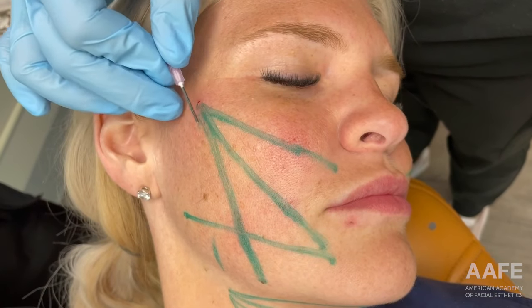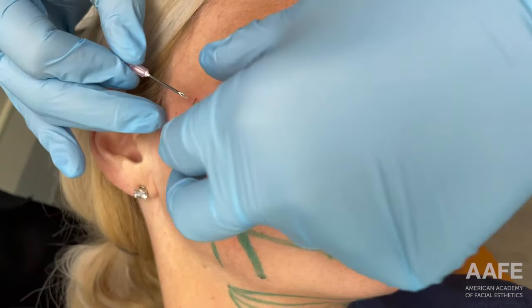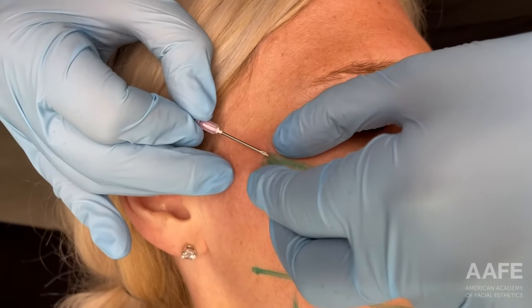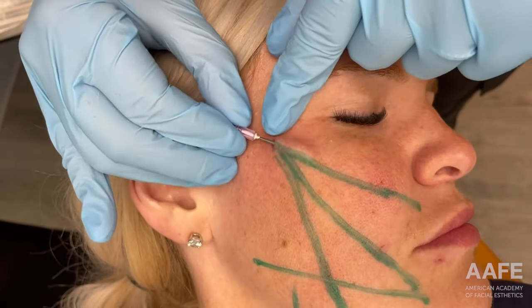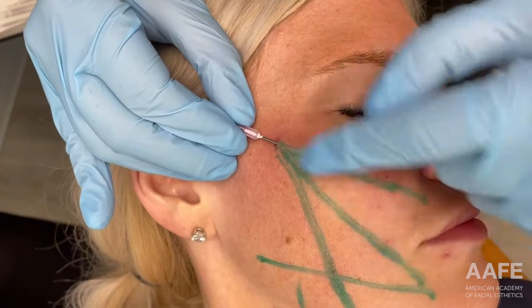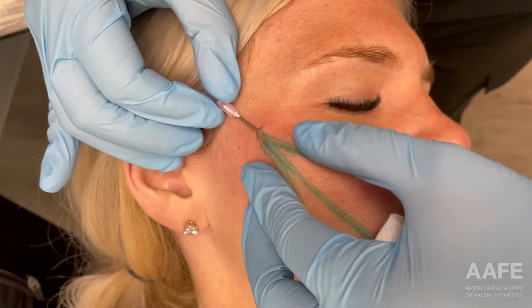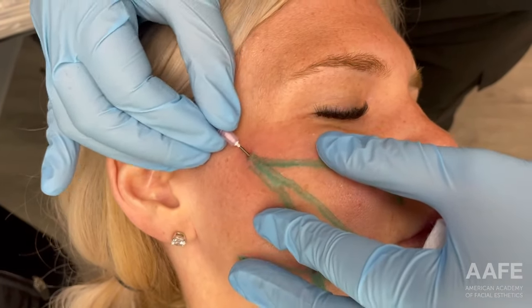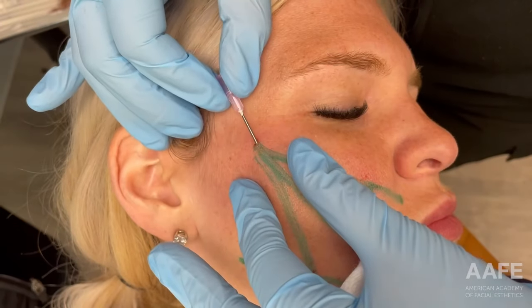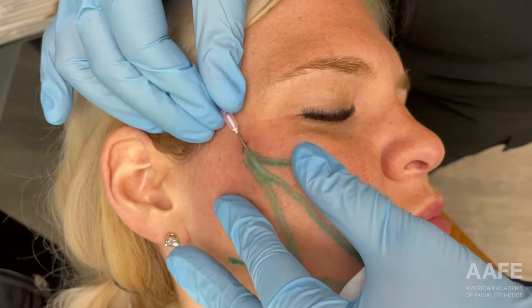You can see I have my three vectors outlined here. I just want to go in and sort of create that path, make sure that I'm in the right plane. Then we'll come back with our anesthesia and give her local anesthesia in the vectors so that she's numb for the procedure. We want to make sure we're in the right depth — I like to think of this as paving the path of where our thread is going to go. We want to make sure it's right from the start.